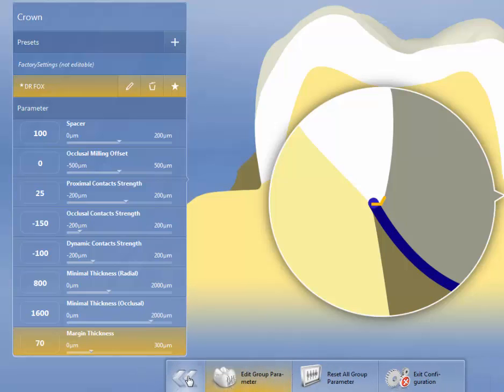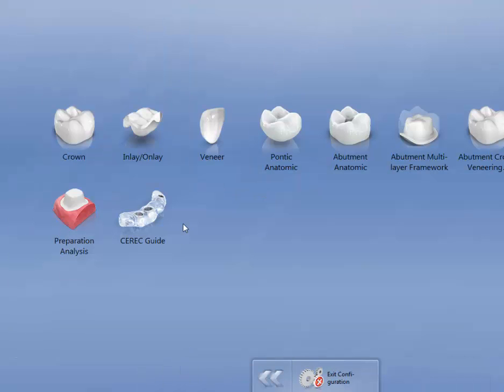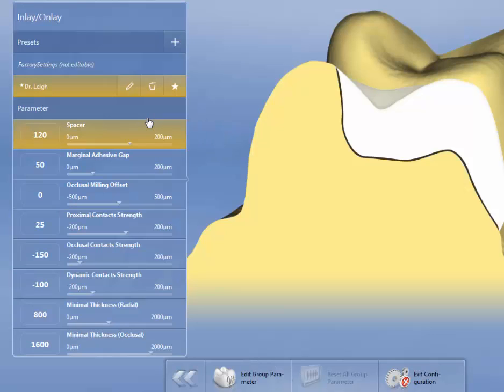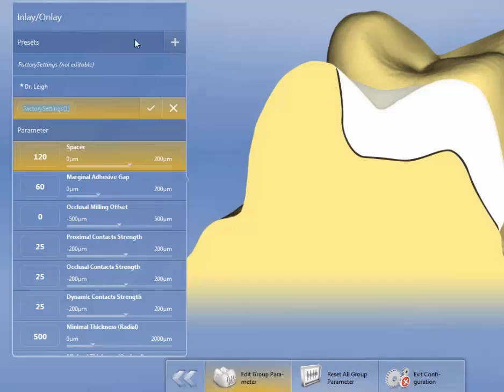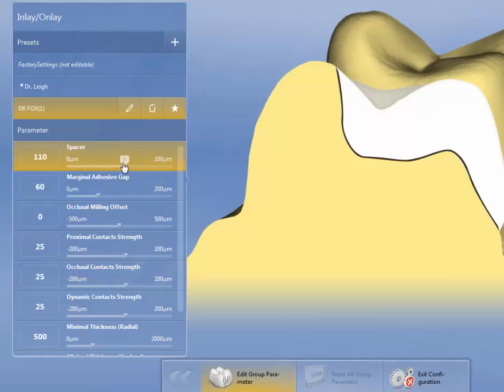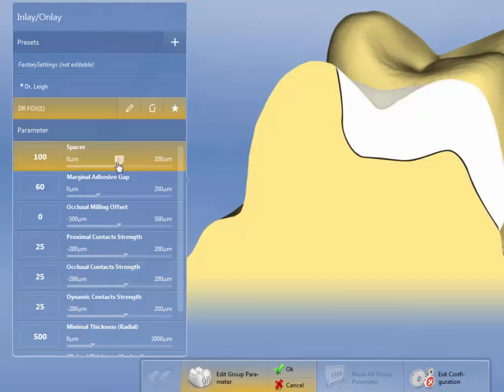And then we're going to go back, and I'm going to do for inlays and onlays. Now, you can see we have Dr. Lee is in here. What I'm going to do is I'm going to add another, and I'll put in Dr. Fox. Again, spacer, I'm going to set to 100 microns.